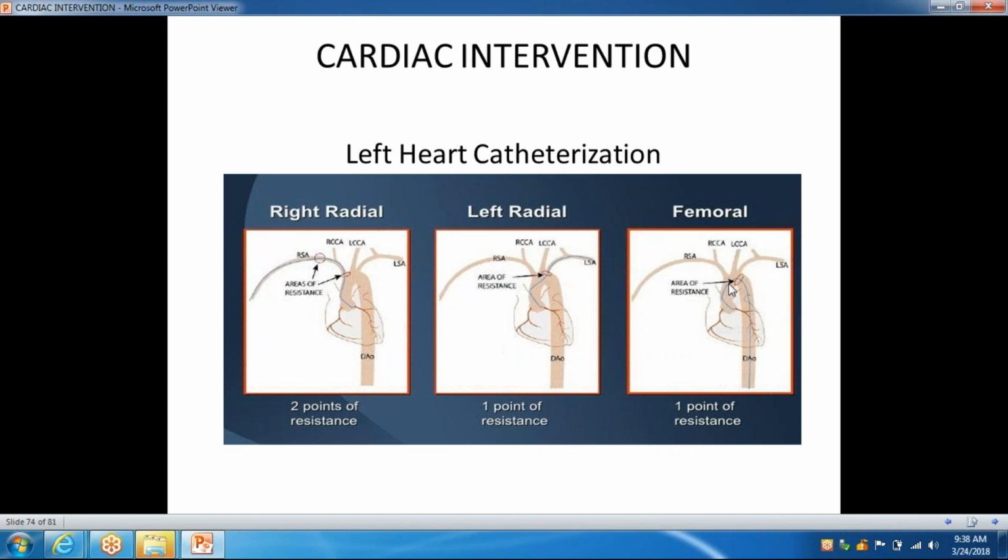You're going to go over the aortic arch, the ascending aorta, and then you approach the blood vessels. Okay, so you can cannulate your left main, and then your right coronary artery. Again, I commonly use, for the left main, a JL4 if I'm doing the femoral approach. That's a left Judkins catheter, curvature 4. Okay, and you cannulate your blood vessel.